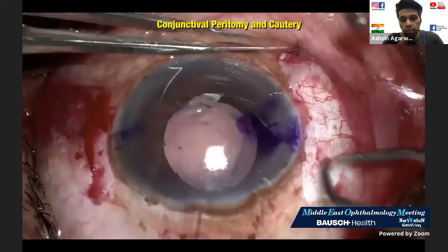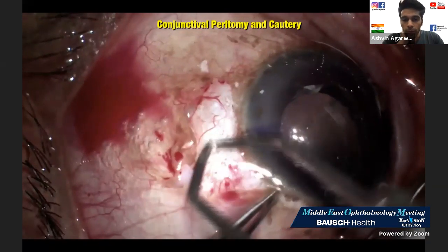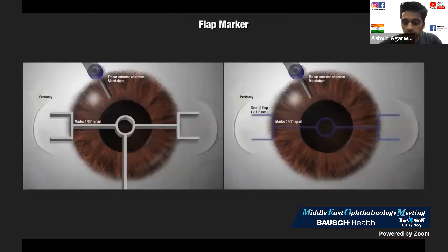This depends basically on one major fact, the horizontal white to white. If the horizontal white to white is anywhere below 12 millimeters, I will make it at 3 and 9 o'clock. If it's above 12 millimeters, I will go vertical, because the vertical white to white is always going to be a little smaller or shorter than the horizontal. Here we go. Next up, I'm going to use my scleral flap marker.